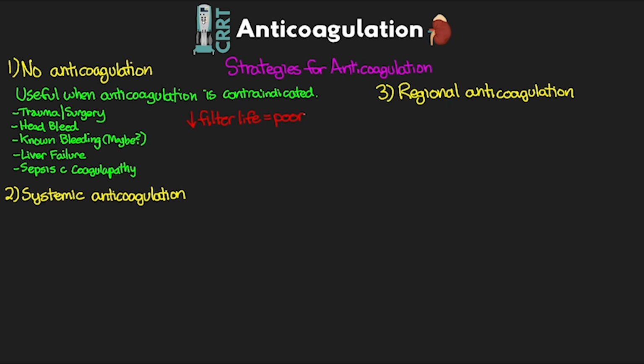And the other potential downside is if the filter completely clots off and we're not able to return the blood while it's still safe, then almost a half a unit of blood is going to be lost. Now, if this is happening frequently, obviously this can lead to need for transfusion for patients.